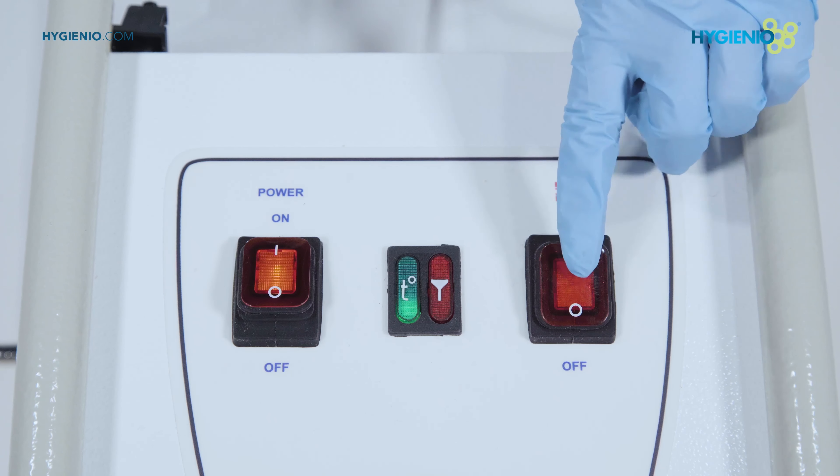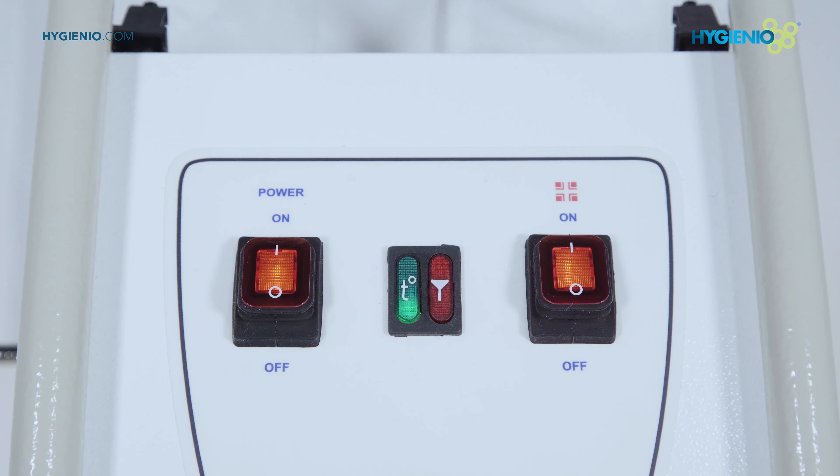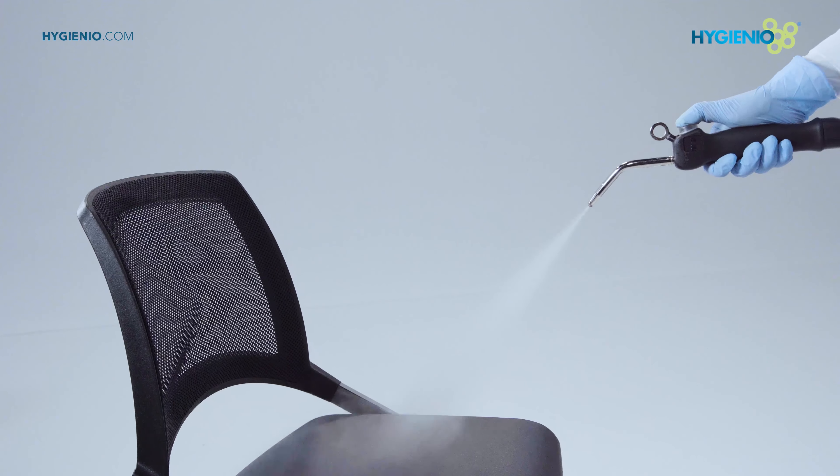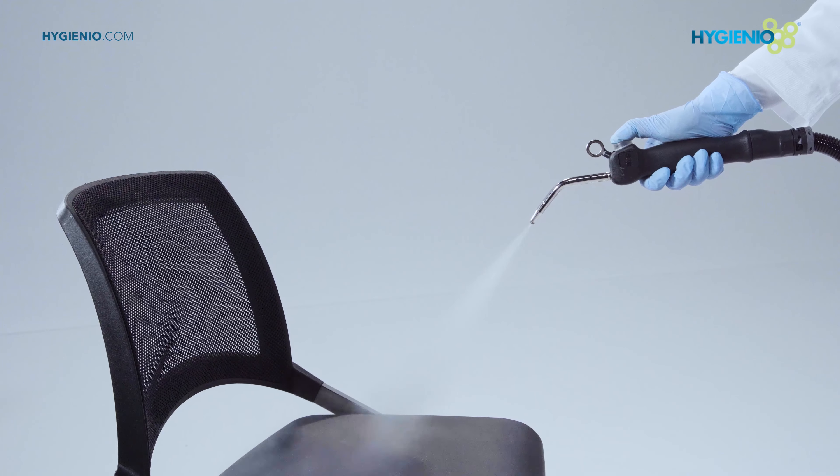Disinfection function. Set the disinfectant selection button to on. Start disinfection by pressing the lance button and move towards the surface to be treated.